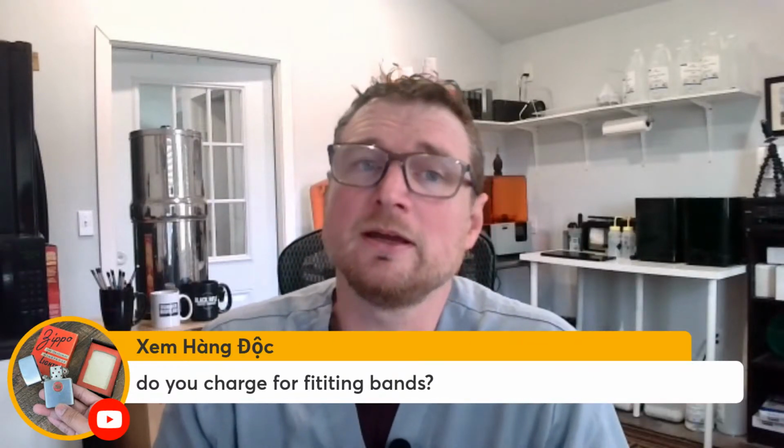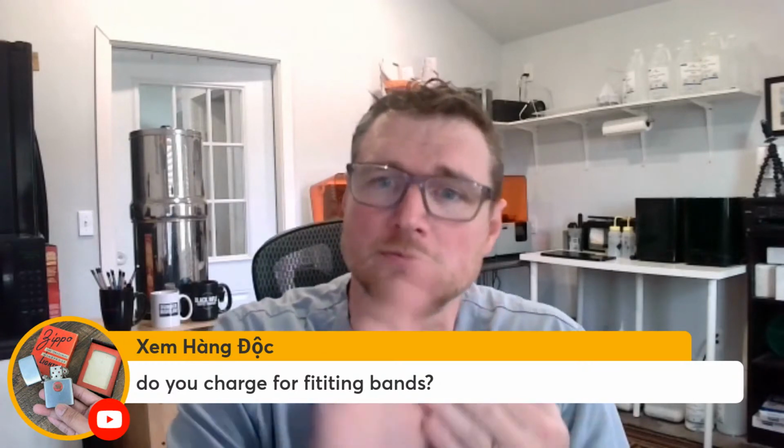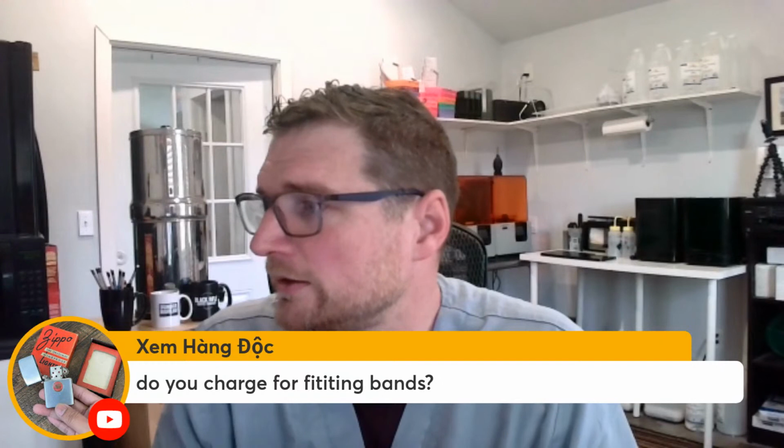Yes, there's a charge no matter what, because there's extra effort, especially when it comes to digital, for doing bands. So yes, I do charge, and maybe if we have some time at the end, I'll show you how I prep my bands. It's a trick I learned from my friend Safan Ali down in Houston. He showed me some cool tricks with that. So let me share my screen.